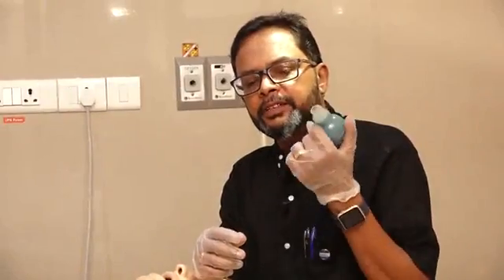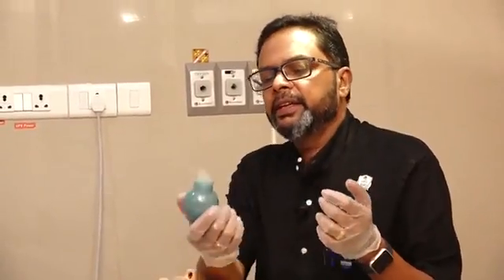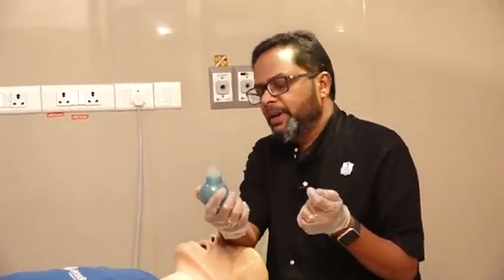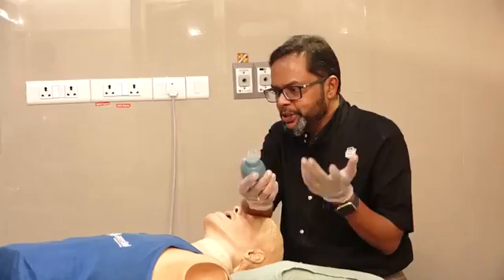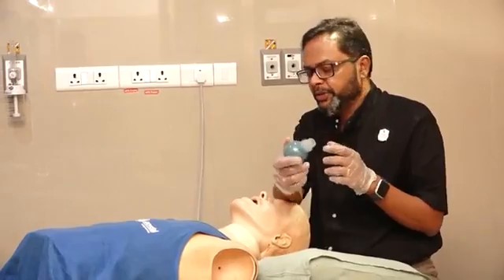This is an esophageal tube detection device, also called an EDD. It is a very useful and very cheap equipment. It is mainly used to rule out an esophageal intubation.